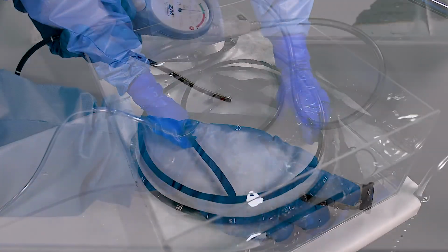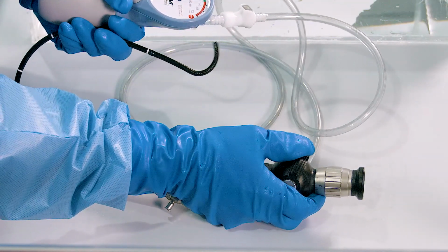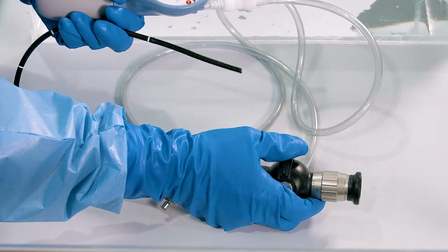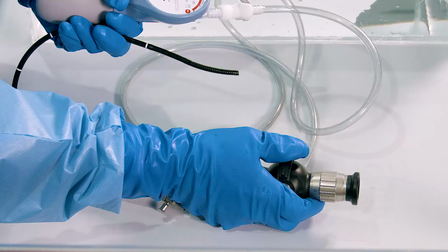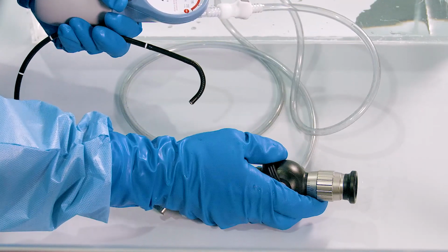Manipulation of the buttons and tubes, and extra examination of these areas during manipulation. At this time, the control knobs and the variable stiffness adjuster for applicable models should be confirmed to be in the free and neutral position. Reprocessing an endoscope with lock knobs or adjuster wire tension will cause damage to the endoscope.